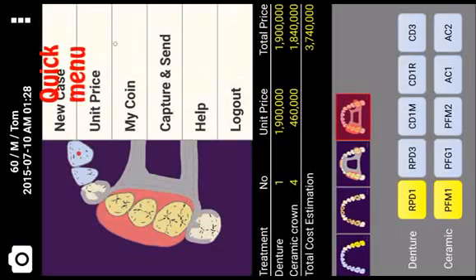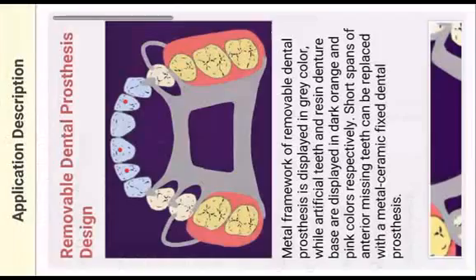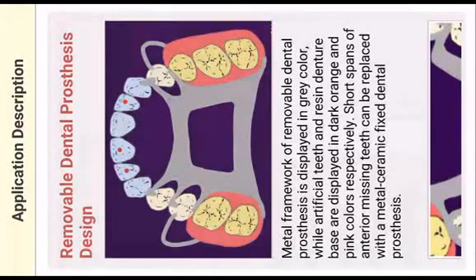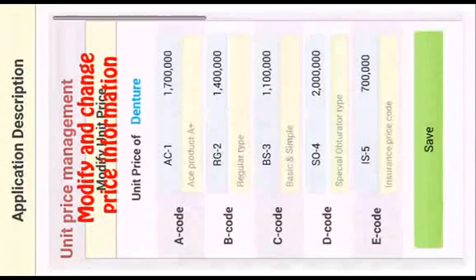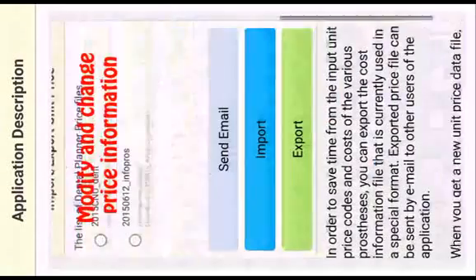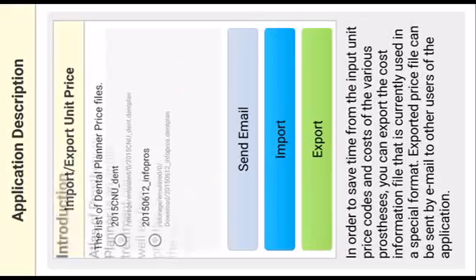The quick menu is located at the top of the page. There is a help menu for removable dental prosthesis. Users can modify the unit price. You can also export and import the unit price information.